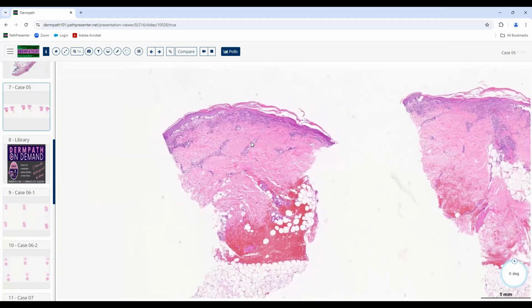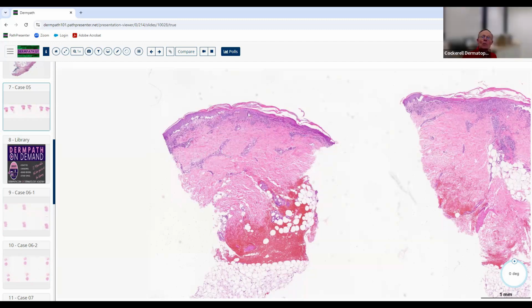Okay, this is a good one here. Yeah, I'll take this one. So this is a punch. Good. And looks like thick dermis, maybe trunk or extremities. Good. And this looks inflammatory. Good. So it looks like the inflammation is right up close to the DEJ. So maybe some interface dermatitis or perivascular, and then there's a blister. Perivascular, but it's interface. I completely agree with you on that.